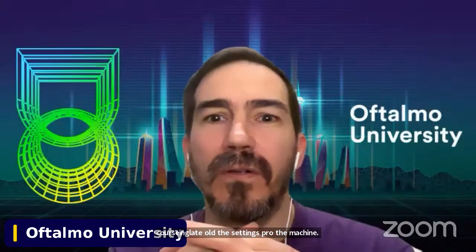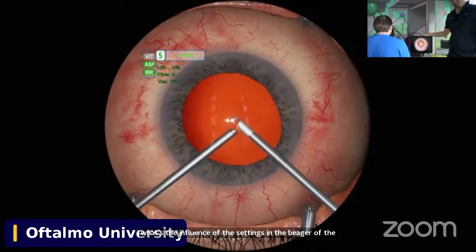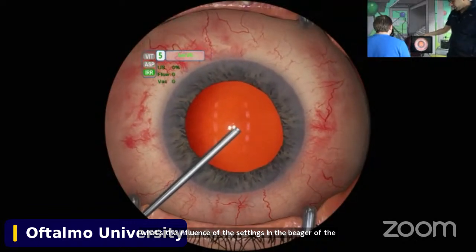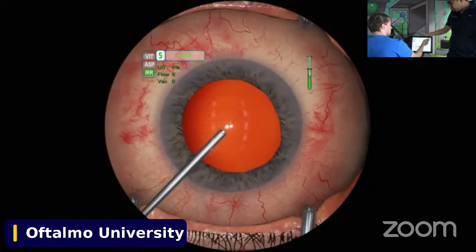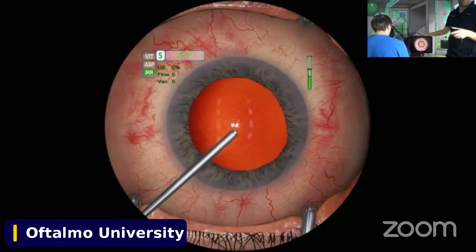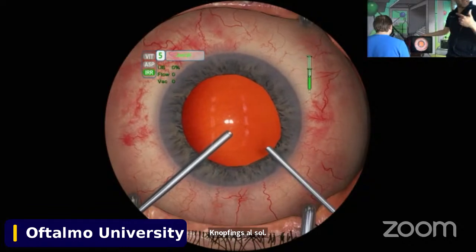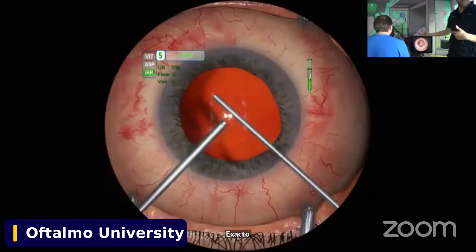Yes, and Oliver, as you said before, you can, of course, simulate all the settings from the machine. You can lower the cutting rate or take it up and see what the influence of those settings is on the behavior of the eye itself. Right, because remember, you have to do slow motion phaco if you still have cortex or nucleus in the chamber, or you can also change the parameters of the vitreous machine. It's not the same cutting vitreous as cutting cortex or other things. Also, the IOP of the irrigation, you can change it.